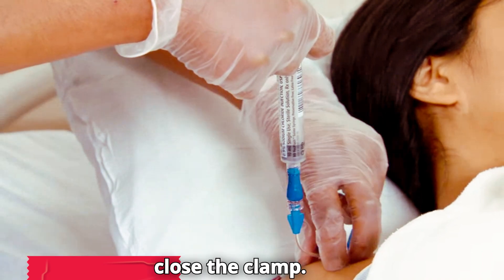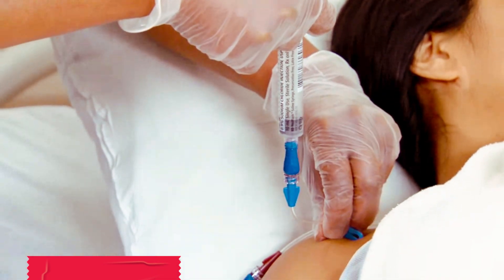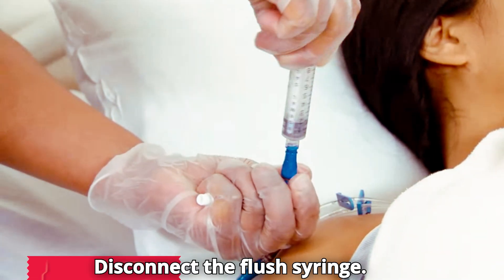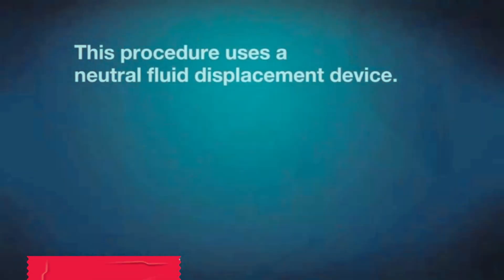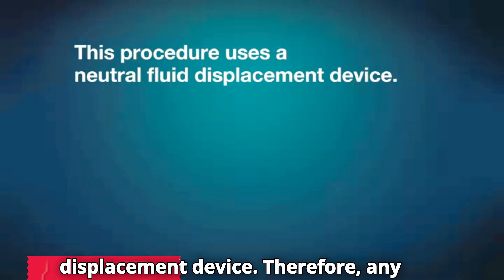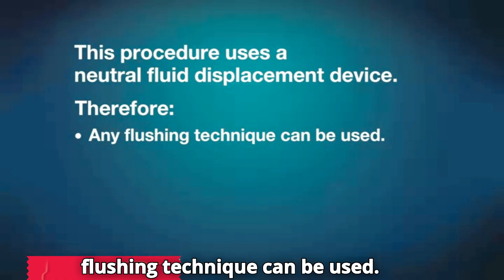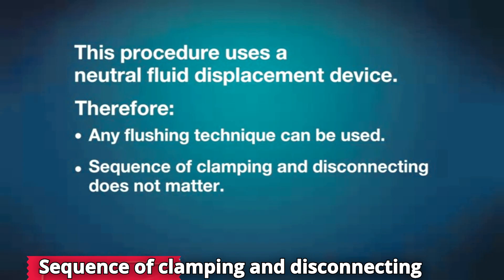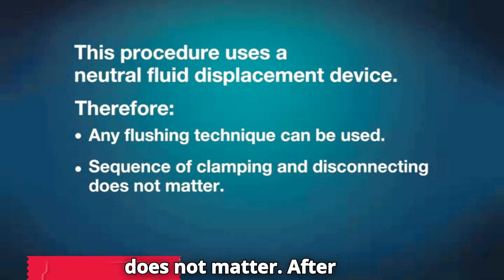Close the clamp. Disconnect the flush syringe. This procedure uses a neutral fluid displacement device. Therefore, any flushing technique can be used. Sequence of clamping and disconnecting does not matter.